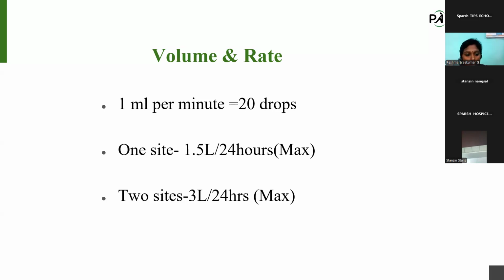Is it correct or not? Or are there no signs of edema or leakage? If there is large edema and leakage, that means you are giving more than 20 drops per minute. If necessary, the infusion site can be massaged to enhance edema absorption. If the patient is experiencing more edema and you are giving only 20 drops per minute, slight massaging will relieve that edema.